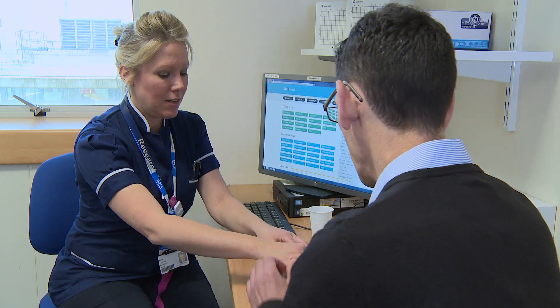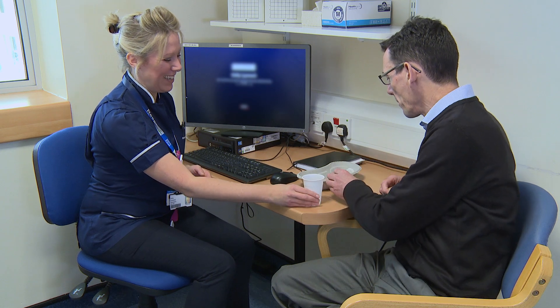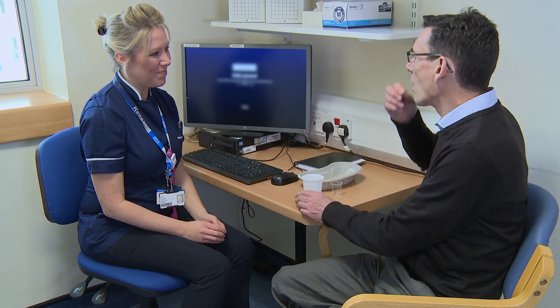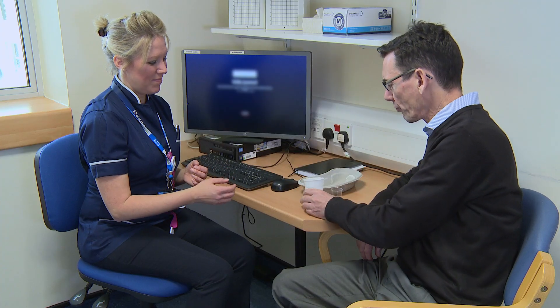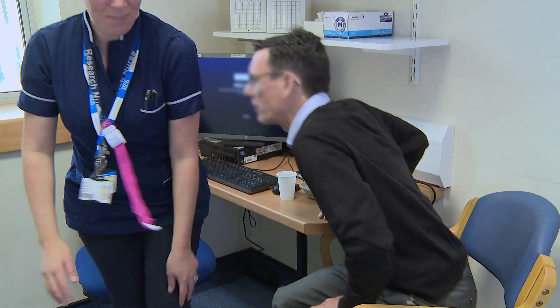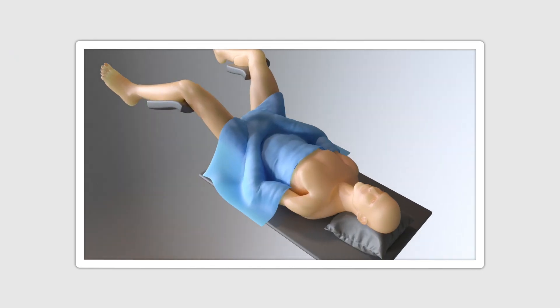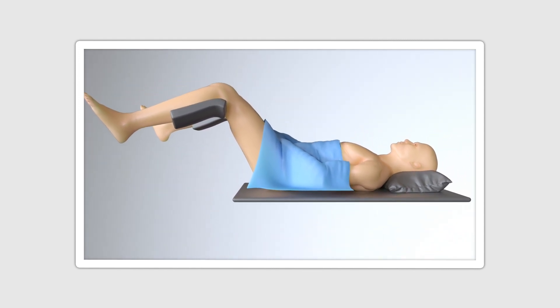The patient is fully informed beforehand of the procedure in the standard manner, and a single dose of antibiotics is administered orally. No other patient prep is required. Suppositories may be used if required and self-administered by the patient 3 to 4 hours beforehand. For the procedure, a reclining bed with removable lower section is required, with stirrups for the patient's legs.